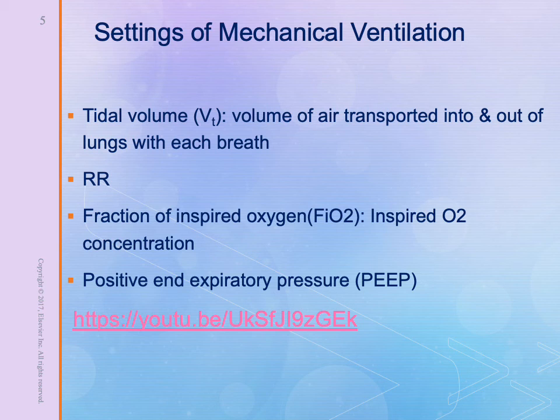The overall goal is to use the minimum FiO2 to maintain a PaO2 greater than 60 or an oxygen saturation greater than 90%. Generally, the patient may be started out at a higher FiO2 and then titrated down.